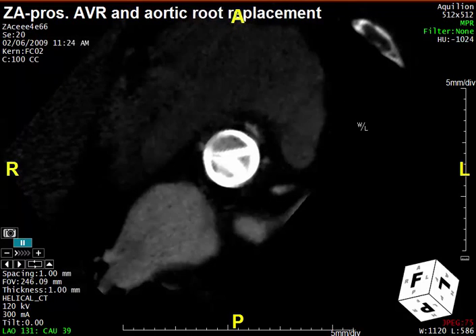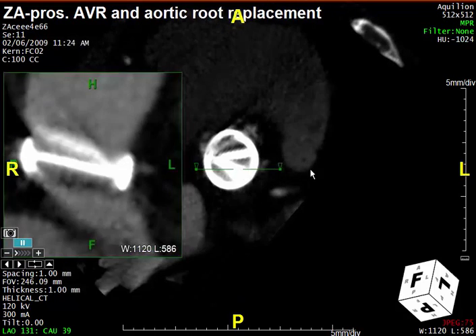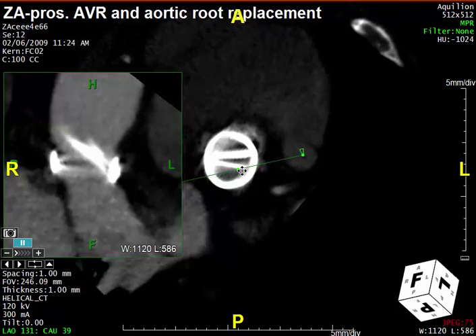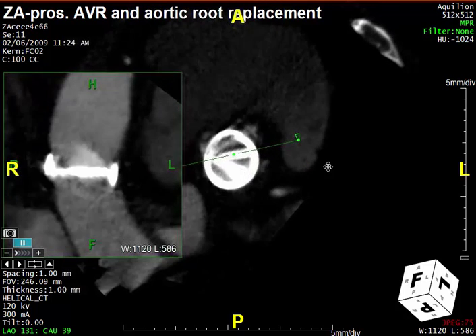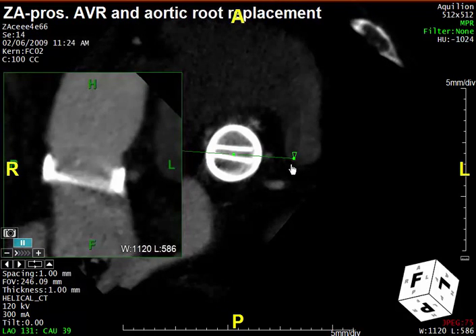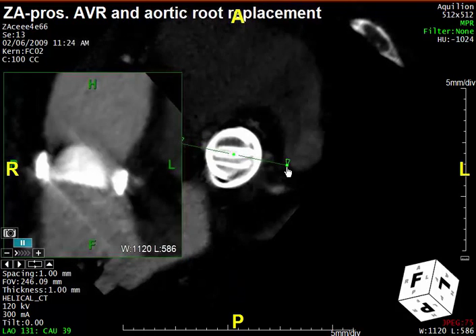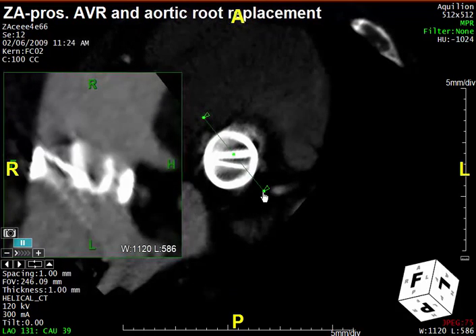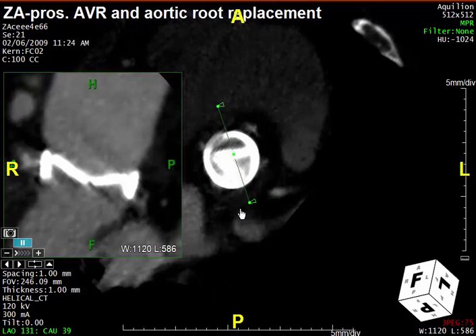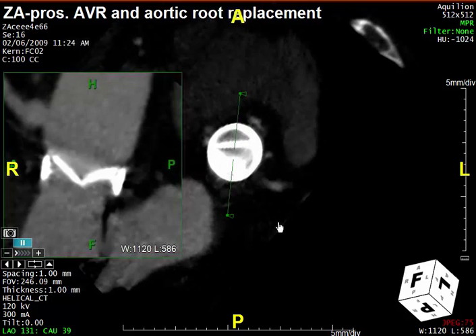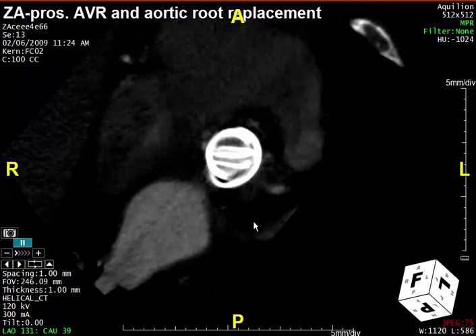We can also do an orthogonal view through this area at the same time. This is done by taking an additional cross-section, which allows us to look at orthogonal views simultaneously. If I rotate this around just a little bit, we can start seeing the valve on plane. Rotating around a bit more anteriorly, we can actually see the valves in cross-section, opening and closing during systole. One can continue around to look at other aspects of the valves.